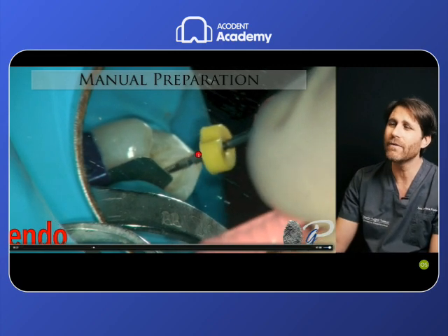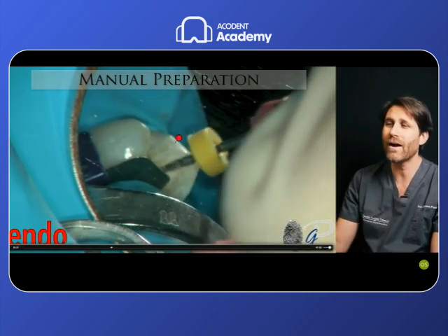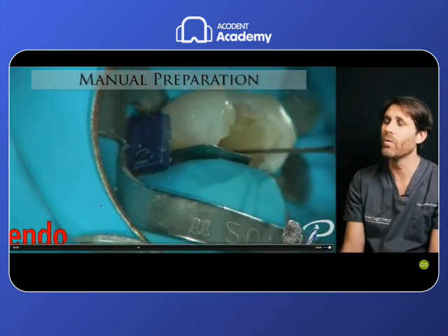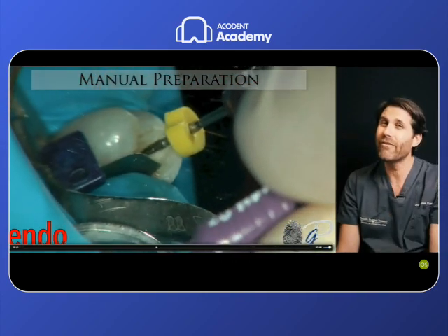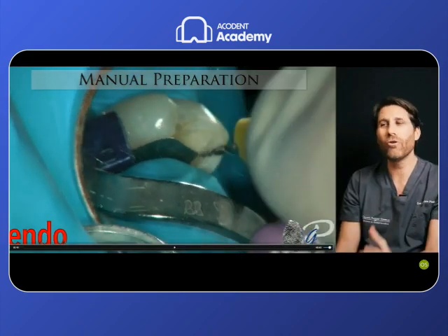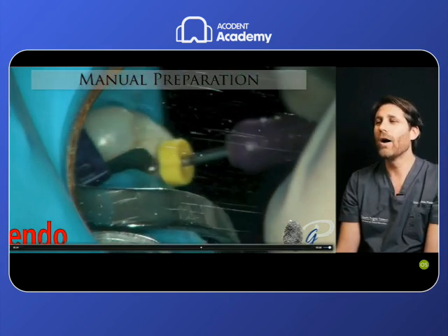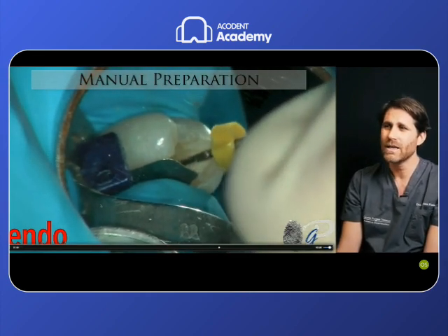And then we go up and down, and if you rotate the file again, you don't find the way anymore, and you have to rotate the file with the precurvature that follows this path, and then you have to work with the number 6, then the number 8, and then the number 10 at the working length to regularize this anatomy. So with the stainless steel file, you are deforming the internal anatomy, taking care not to deform the apical foramen. But these rigid files used with this technique aim to make an intentional deformation of the anatomy of the root canals.